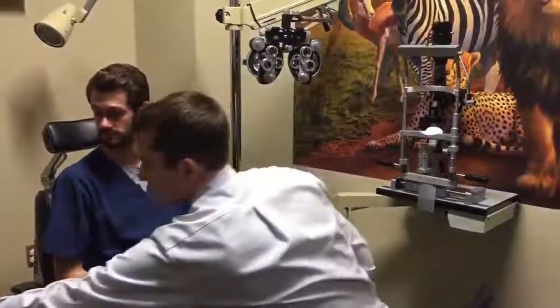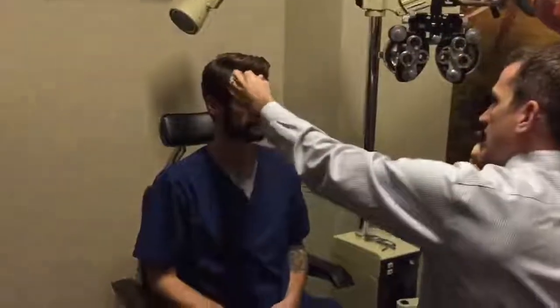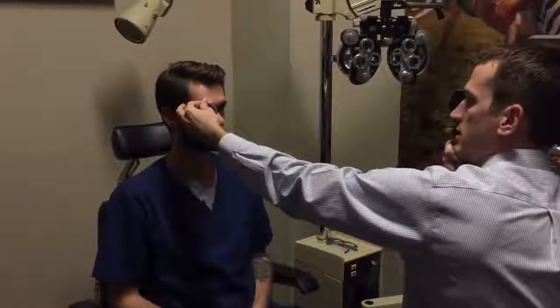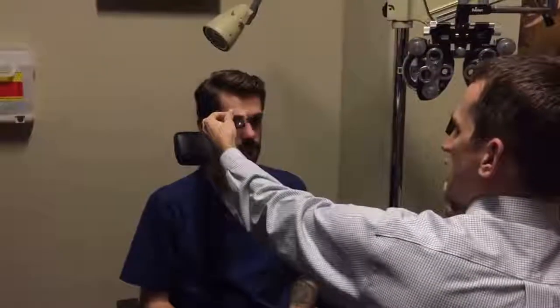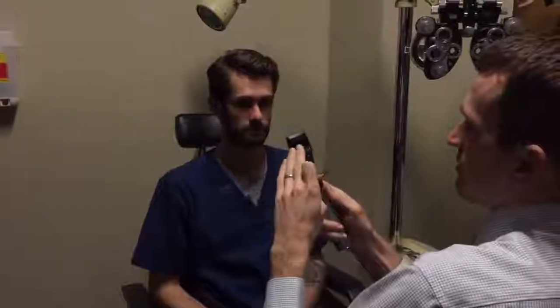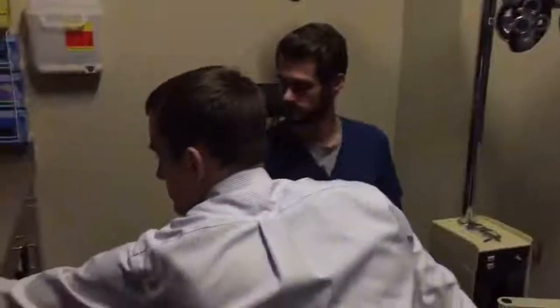And the way that we do this is by holding up different lenses in front of the patient's eye. You usually dim the lights just a little bit, and generating that light beam that you see there, and moving it up and down, and then side to side. And we check up and down first, and then side to side, and our goal is to hold up a lens that when I look through the little hole on this retinoscope here, the whole eye will just fill up with light. And when I see that, I know that I've figured out what the glasses prescription would be if the child needs glasses.